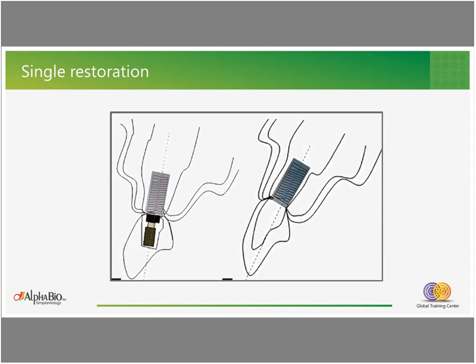The implant angulation can influence the decision of when to use screw-retained or cemented restorations. The correction of the implant position can be done easily when we use an angulated abutment for a cemented restoration. Using screw-retained in a single restoration when we have an angulated implant position can be more problematic, so the implant position has to be a little bit lingual, like in this situation, in order to make it easy to make screw-retained restorations. When we have to go with the same axis of the implant and we have an angulated implant, the axis of the screw will be too buccal, and this can influence the aesthetic outcome of the case. In some cases, we have to make it screw-retained. We can correct the angulation of insertion using a special abutment called angulated multi-unit abutments.